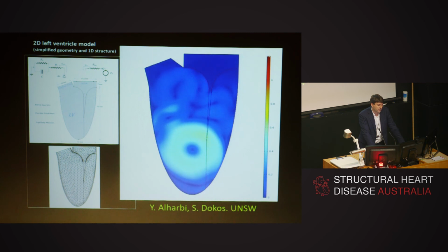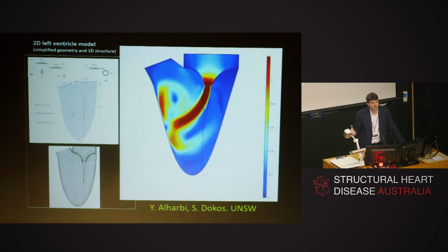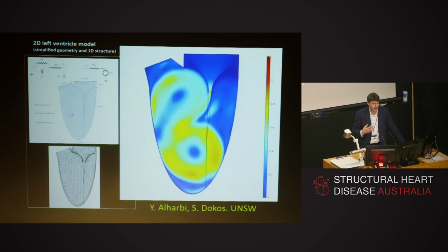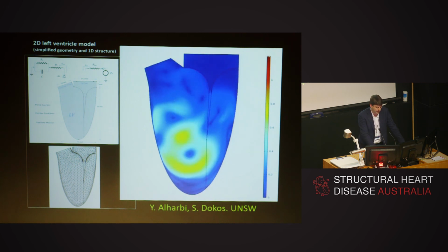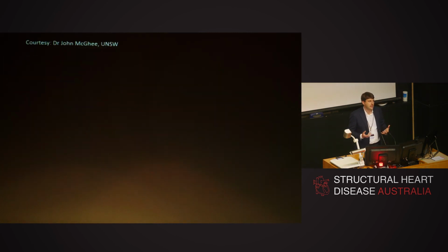There are lots of other forms of modelling we can do. Again, this is a 2D simulation, but 3D simulation of mitral inflow can be used, and we can compare that again to 4D flow data from MRI. So really, 3D imaging is the key.